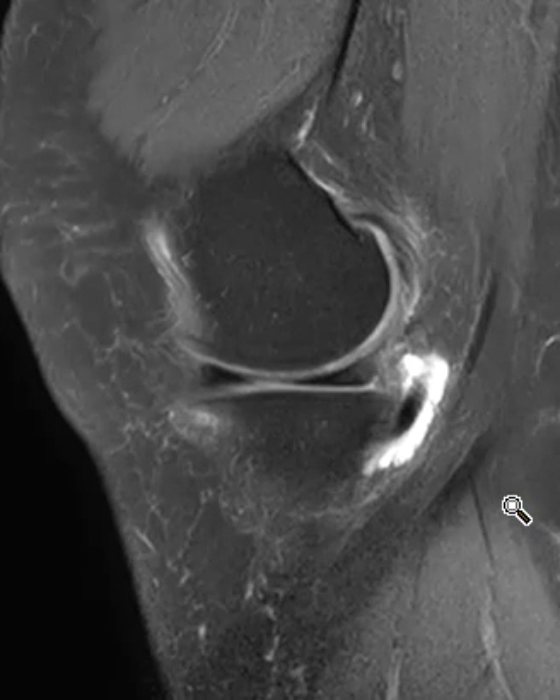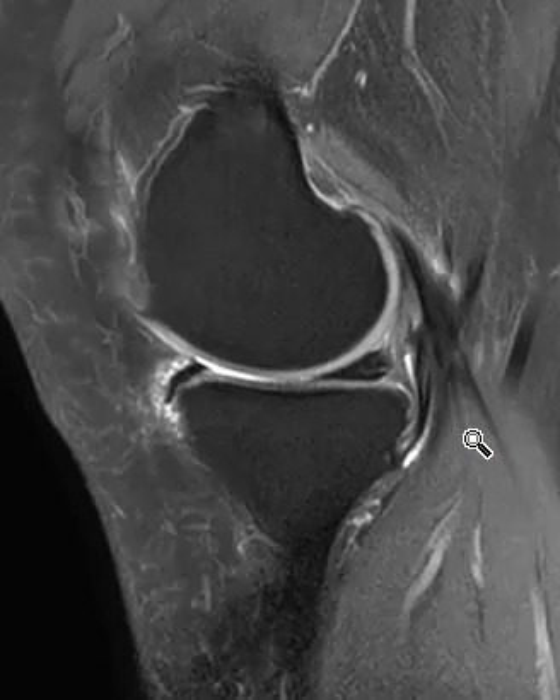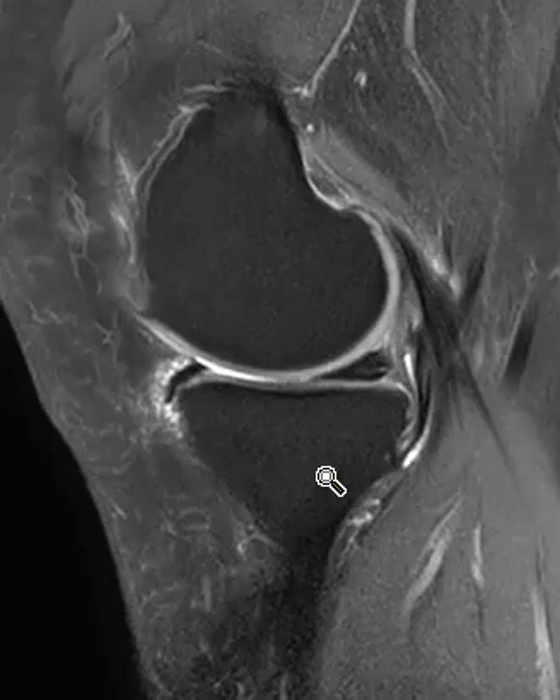She does have chondromalacia patella, but in addition she has an abnormal finding over here in the posterior medial — the back medial side of the knee. To get oriented, this is the femur and this is the tibia.